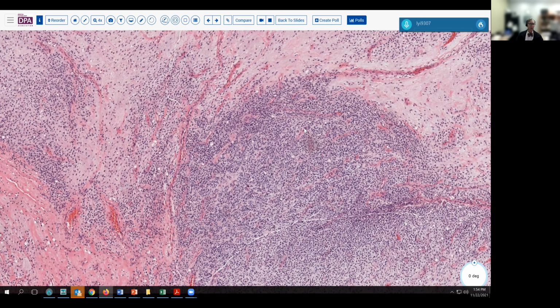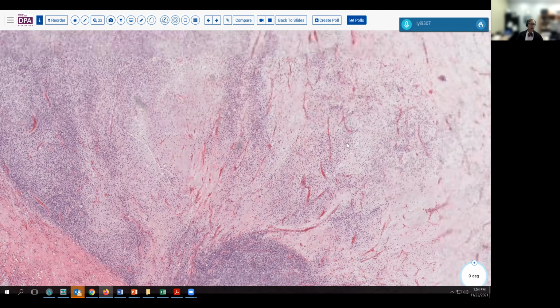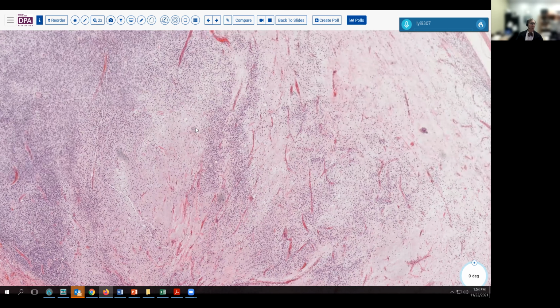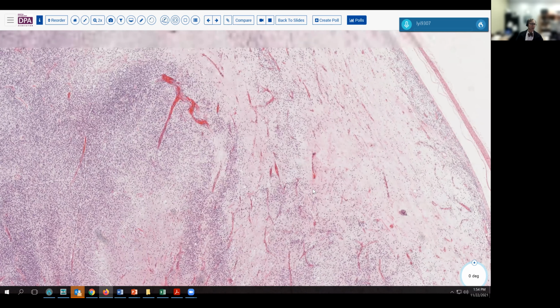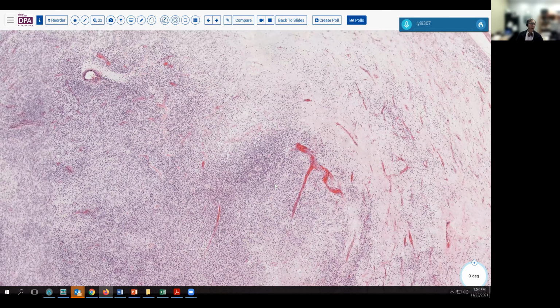And so this again points up the value and importance of the FISH testing for these translocations to be able to ferret out the specific diagnosis. But I did want you to have a good feel for the morphology here. I'm not a molecular pathologist. I'm not a FISH testing person per se, but I do think that we can see a lot and get a long ways if we know the proper morphology and are recognizing the vasculature, the myxoid and round cell features that can help to steer us towards the diagnosis of myxoid or round cell liposarcoma.